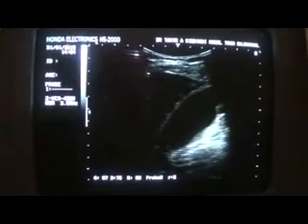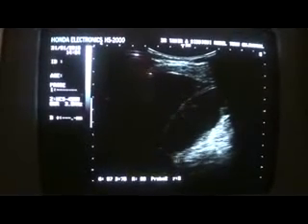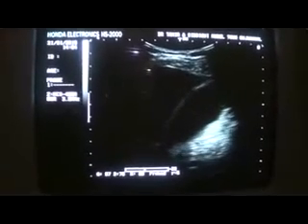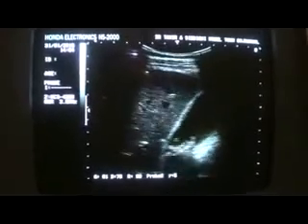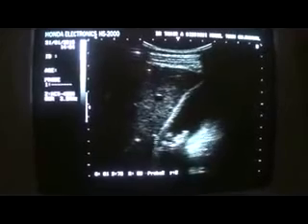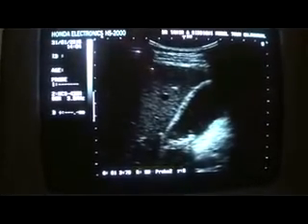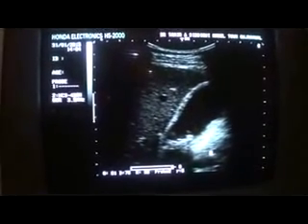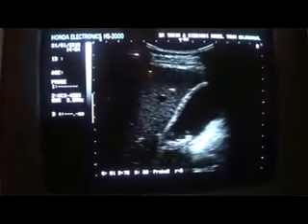Not the kind of shadows that we see in calculi. Here you can see the movement. You can see the movement. However, when we see the calculi, they will remain where they are unless you ask the patient to change his posture. See this, you will see again a shadow from this area, because these also appear as calculi. Now, true calculi are these ones, giving sharp posterior shadow.